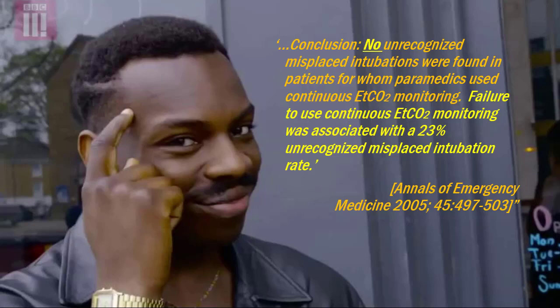Another study in the Annals of Emergency Medicine, I really want you to take this to heart. Zero, nil, zilch unrecognized misplaced intubations were found in patients where paramedics used continuous, not single use like with colorimetric, but continuous end-tidal CO2 monitoring.